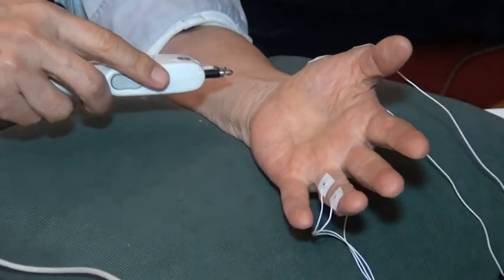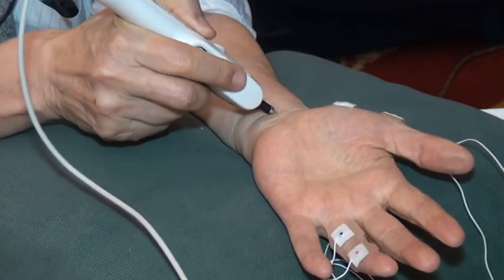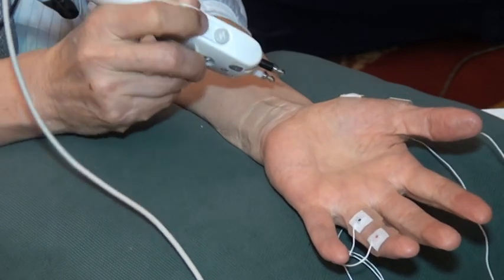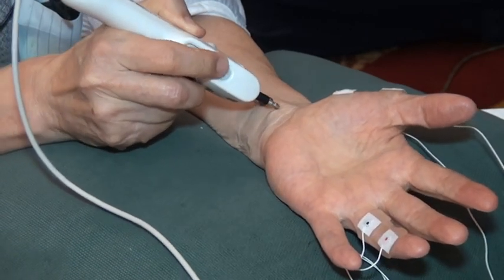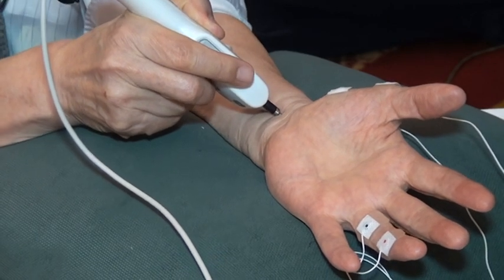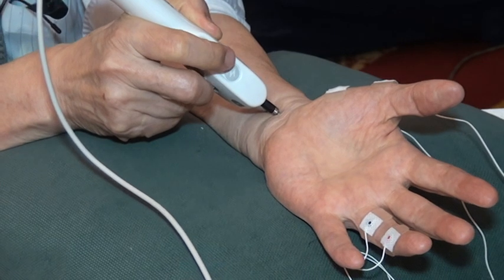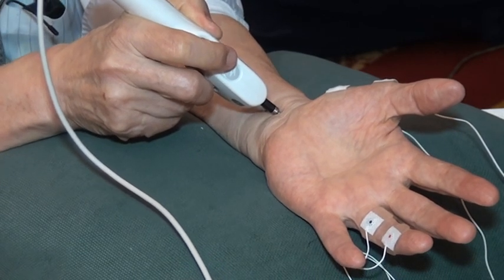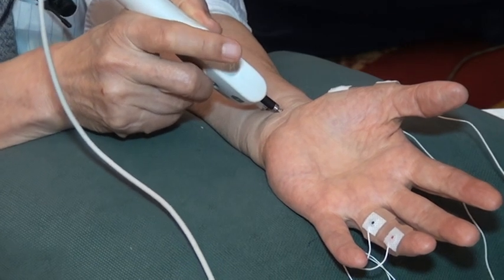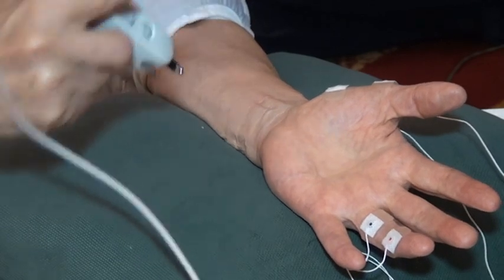Okay, erase that, and let me go back to the median nerve. I'm going to stimulate the median nerve once, like that. Now, let me try one more time with high intensity. And remember, there is such a thing as maximum and submaximal response. Usually you start with small intensity, and as you increase the shock intensity, the response grows until it plateaus.